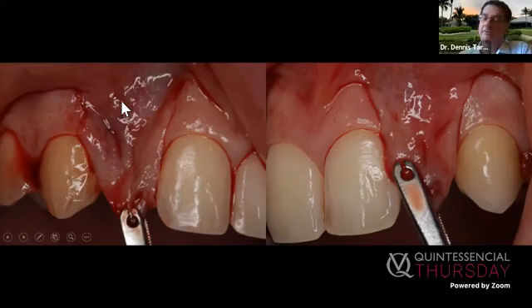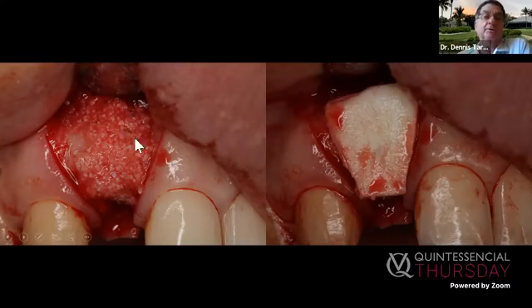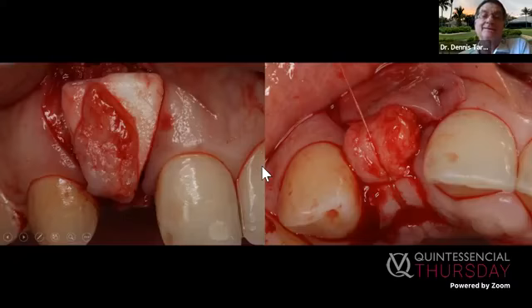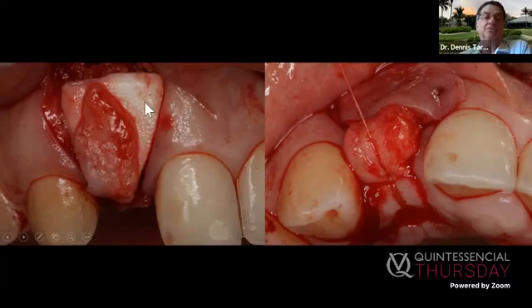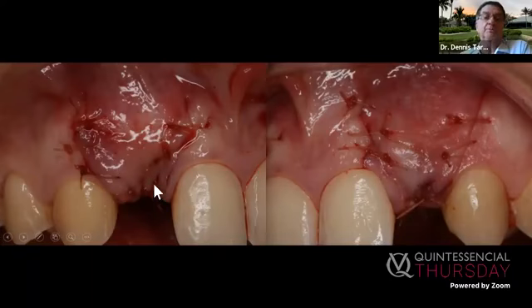That's the key. Everybody knows that. Uli did that. Everybody's done it. Stefano Urbanolo, great clinicians. Everybody learns how to release it, or else you'll have failures. Then I put a graft in, and then a membrane over that, and the connective tissue graft over that to cover over the hole. So I got a triple layer. I've got bone graft where the bone is deficient. I put a membrane over that for GBR, and I put extra soft tissue over that from the palate, as you see here, a triple graft. Covered it over, sutured it in place, leaving my papilla intact, as you see.